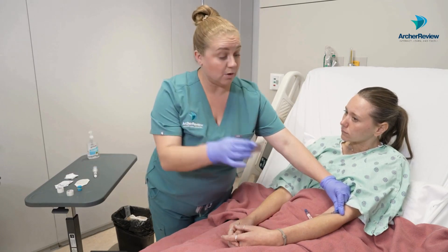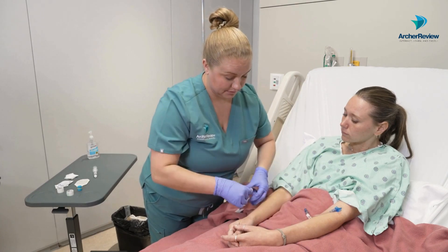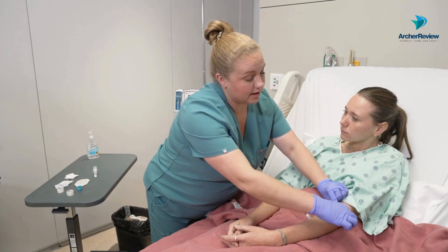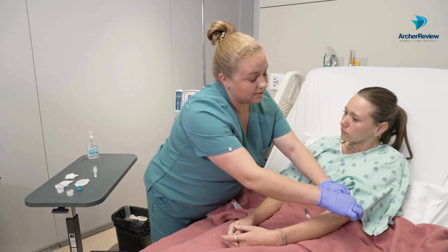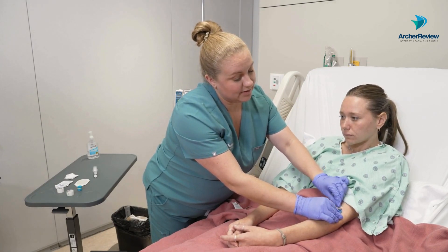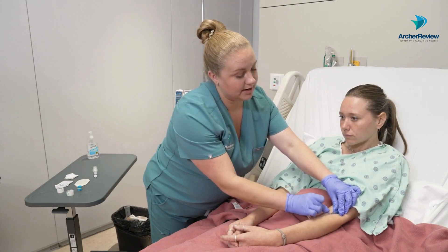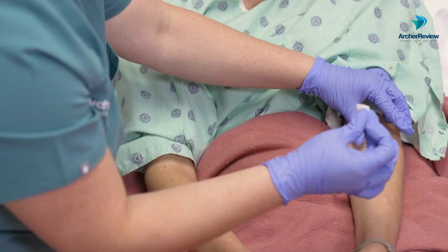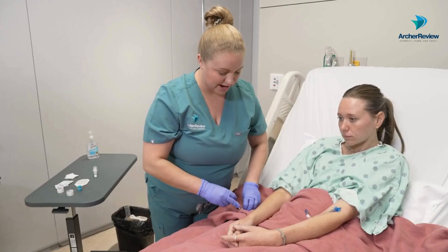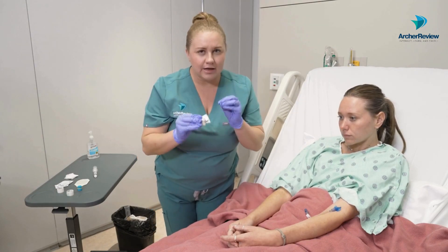We've got our alcohol swab right here at the ready. Let's open that up and go ahead and clean around the area — get all of that residue off. Again, just keeping a hand on that IV site so it doesn't wiggle anywhere. I like to clean under the hub. And just like when we inserted, we need to let that dry so it kills off all the bacteria, and we don't want to touch that area again and contaminate it with our dirty hands.